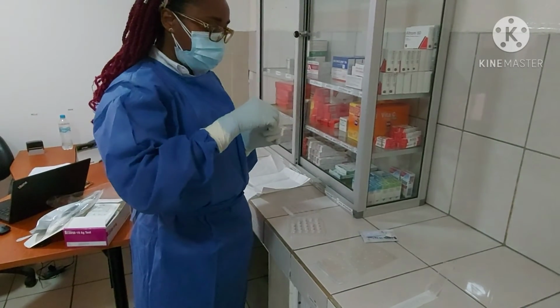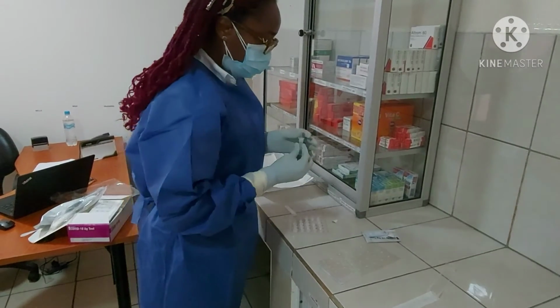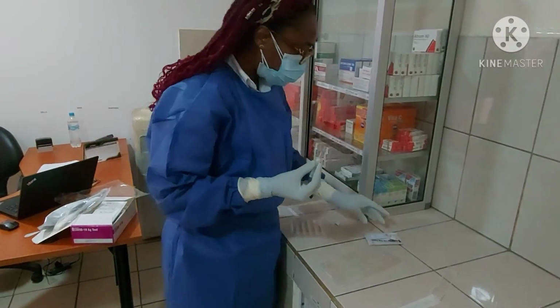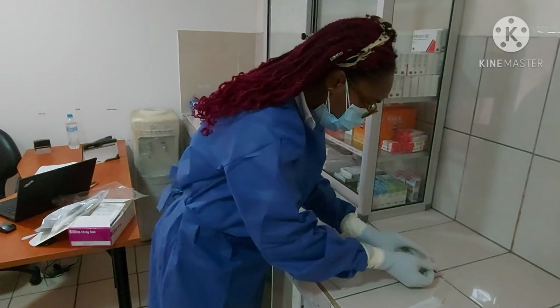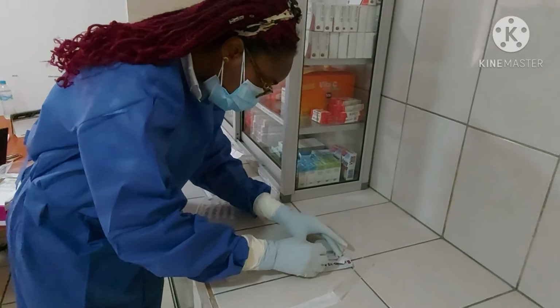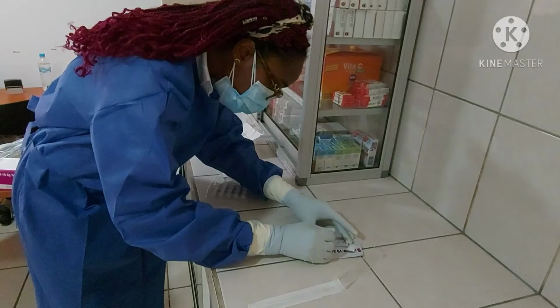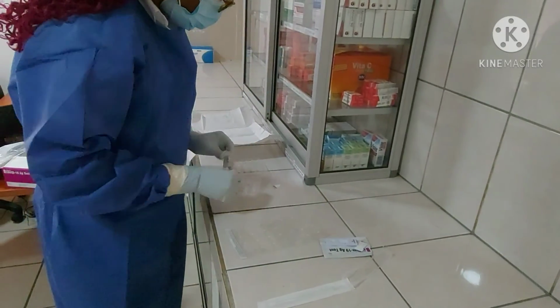There is a top for that container. We're going to place that top. That top has a hole that makes it possible for the liquid to come out in drops. So now we're going to place 3 drops of this liquid mixed with the sample we've gotten from the nasal cavity in the cassette, just like we do with the blood from the rapid test.